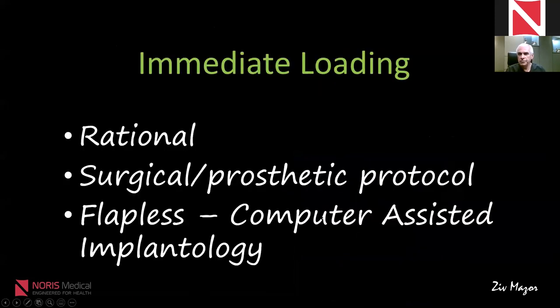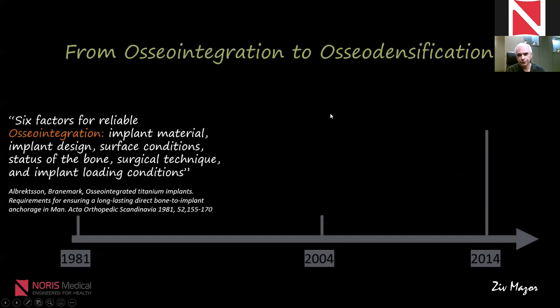Now, let's first talk just a bit about immediate loading. And we will talk about the rationale, the surgical or prosthetic protocols, whether to do it flapless or computer assisted. And those are details that we have to take into consideration when we plan our everyday case.